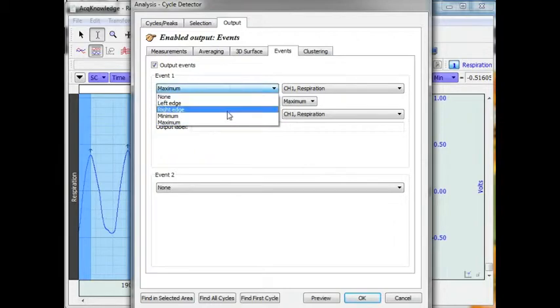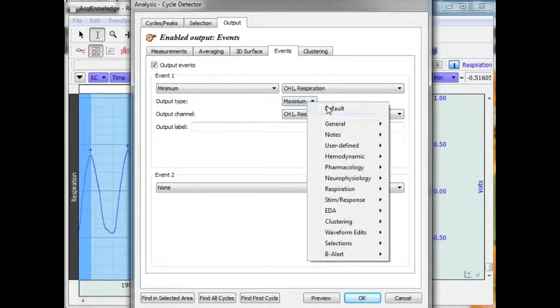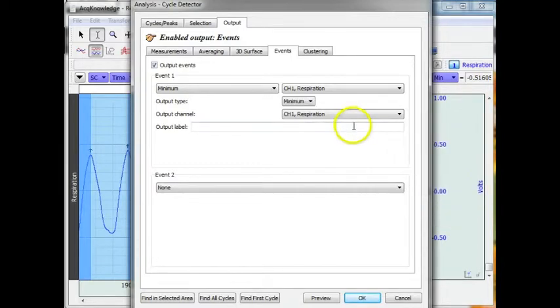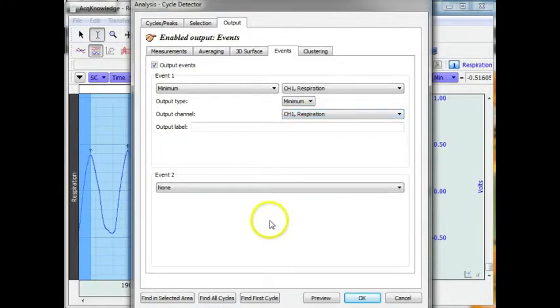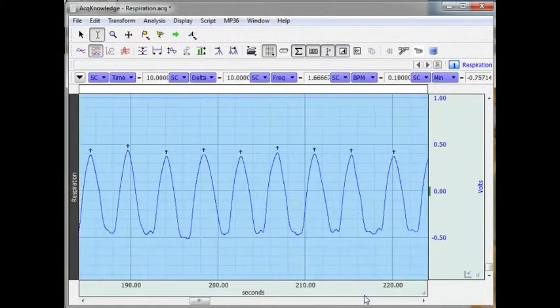This time I am looking for the minimum. And I am going to use minimum which is a downward arrow. And it is going to place the arrow on the respiration signal. Hit OK.